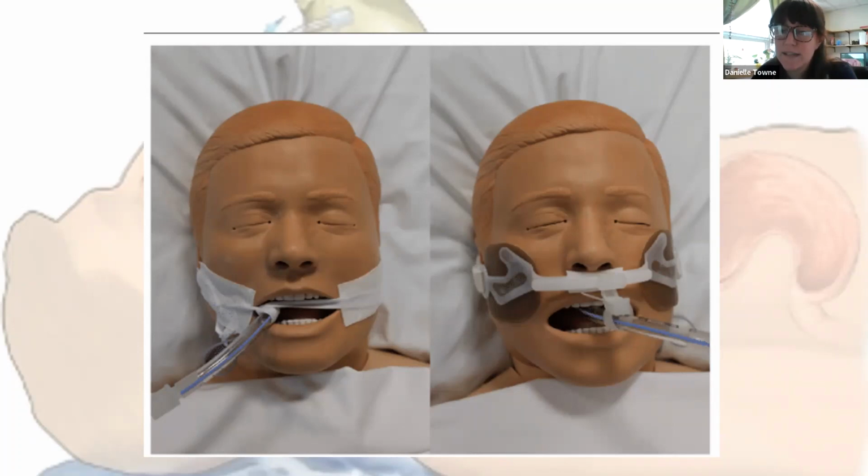If you're listening to lung sounds and you don't hear lungs over one side, there are a couple of things that could mean. Either your ET tube is too deep and needs to be pulled slightly back because it's gone too deep down the right or the left main stem, or maybe your patient has developed a pneumothorax, and that could be why you don't hear lung sounds, because that lung is collapsed. There does need to be confirmation at the time of placement of the depth of the tube. This can be described at the teeth or the lip. The tube is then secured at that location and will be used as a reference point moving forward to ensure it's still in the correct place.